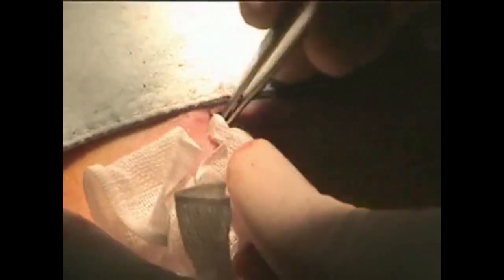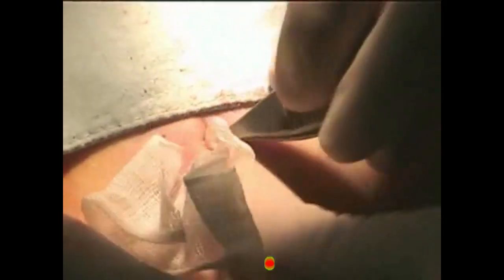Pack the cavity loosely with packing material, preferably iodoform gauze. The length and width used for the packing depends on the abscess size. After packing the wound, leave a small tail of gauze protruding from the wound to allow for drainage and eventual removal of the gauze.